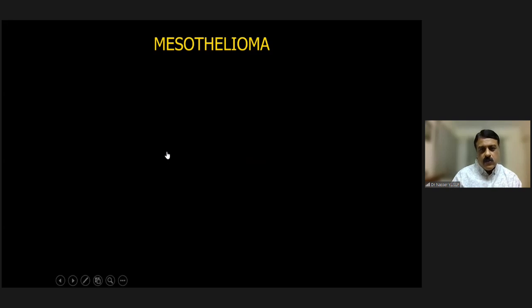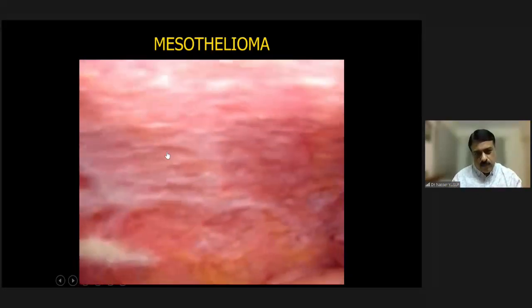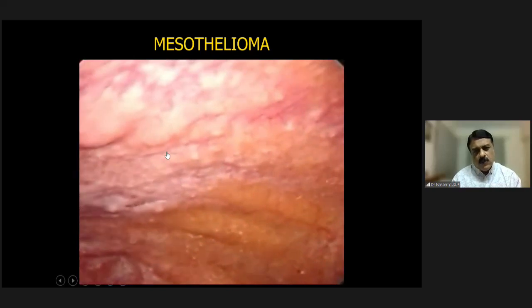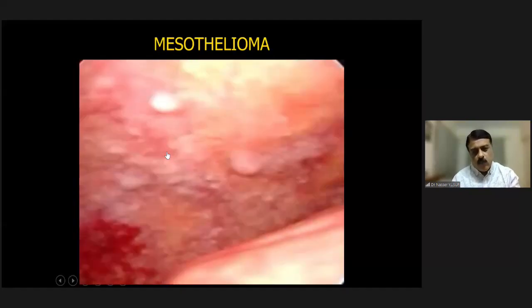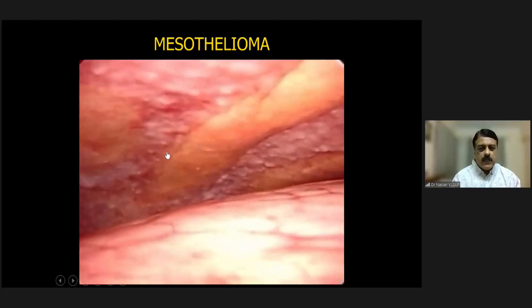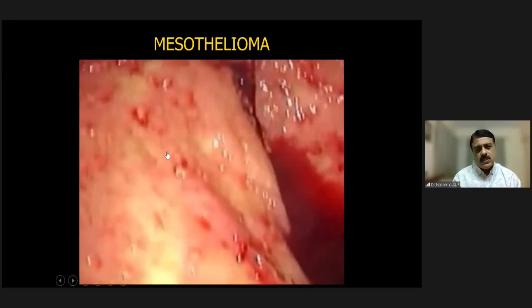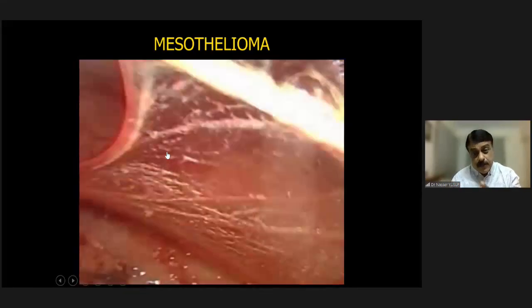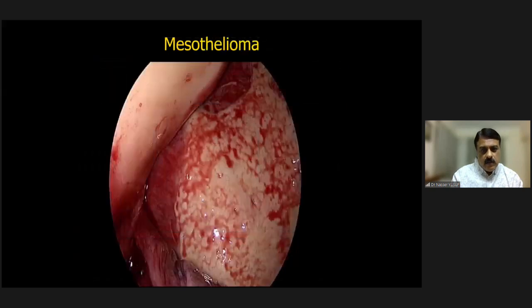Pleural effusion, I'll take you through a small video of an unusual diagnosis. Clear fluid, and you see the pleura with small nodules. This is classical of the entire thing. You don't see any normal pleura at all. And see the water, the fluid was like water. It was a mesothelioma. And look further down at the diaphragm. There's another patient we have conjoined. You see a coarse appearance of nodules, and flimsy adhesions that you could possibly deal with. And this is more sinister. This is again mesothelioma, very sinister. A forceps rigid biopsy will set the diagnosis at rest.